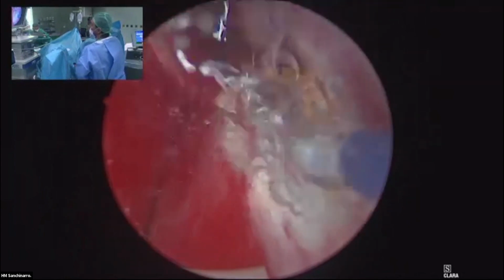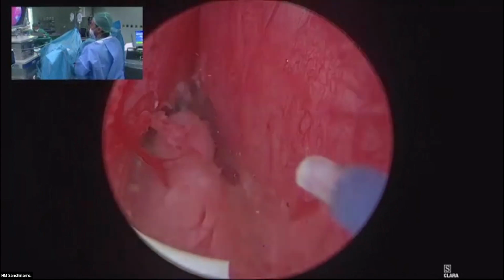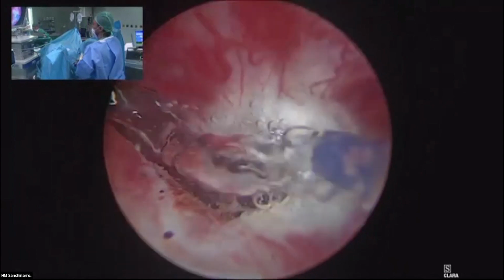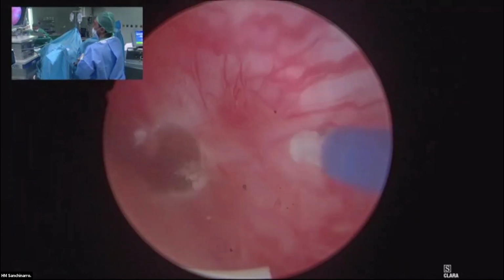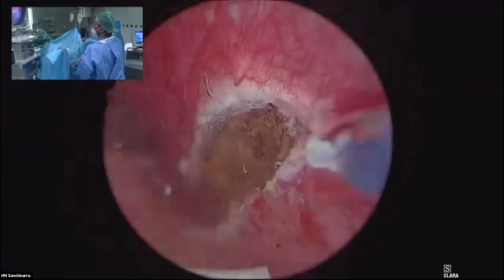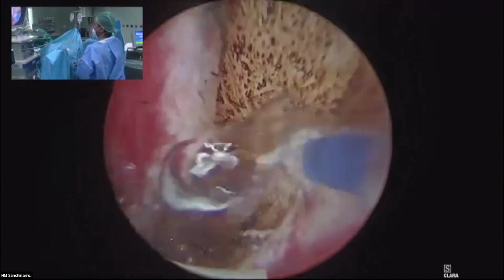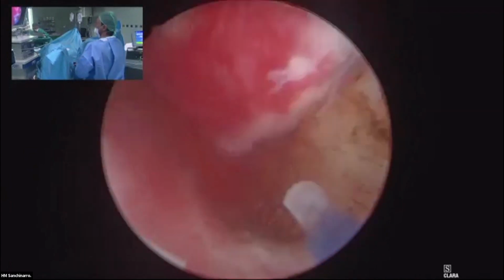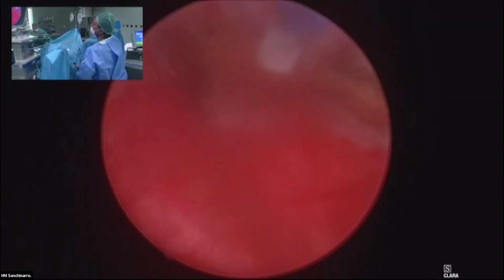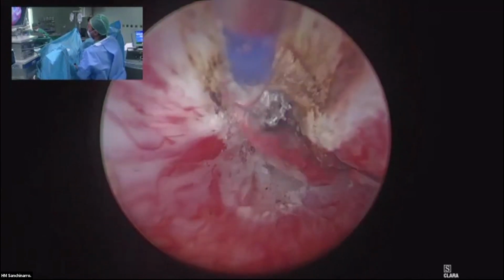traction we do. And if we don't cut the mucosa first, the problem is that the mucosa is the most powerful part of the prostate that keeps the prostate attached to the sphincter. Once we have cut the mucosa, when the inclination changes from the urethra to the lateral lobe, you can do a little bit of traction, so you can find easily the plane in between the bladder neck, the capsule and the adenoma. So I've cut the mucosa and I've reached the incision I've made here.